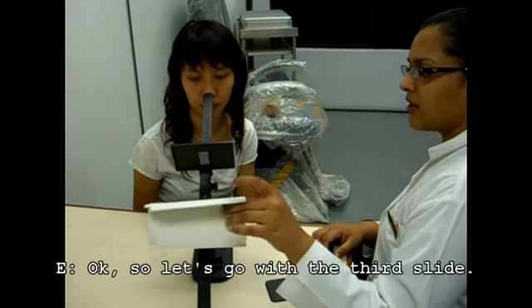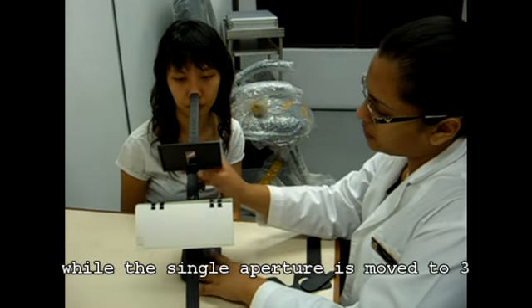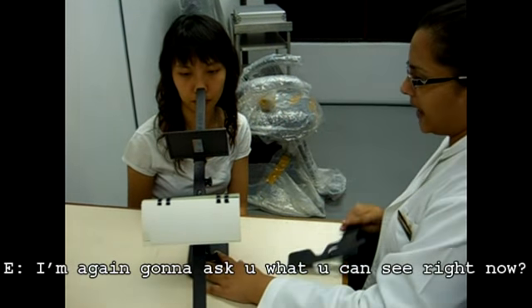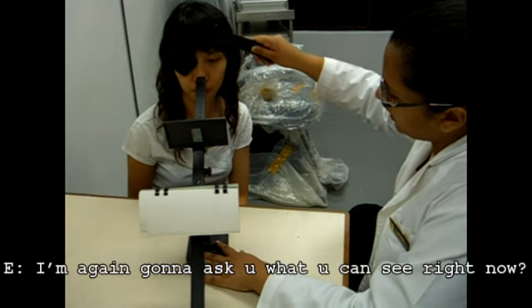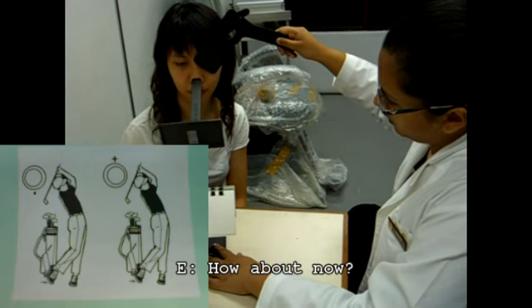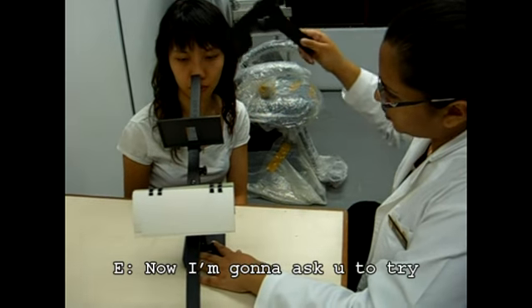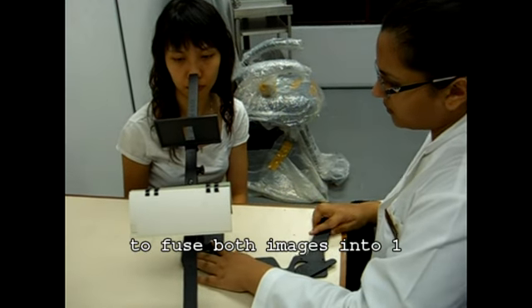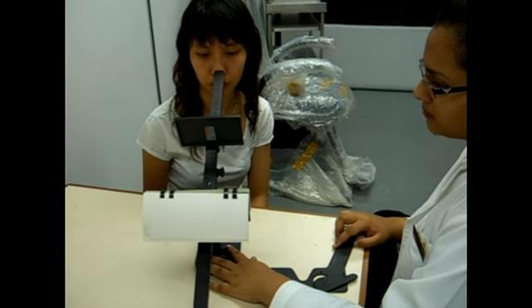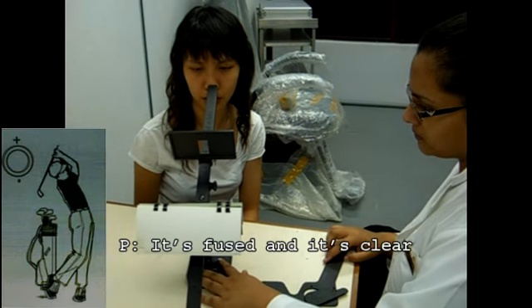Okay, so let's go with the third slide. The booklet is placed at 0, while the single aperture is moved to number 3. Again, what can you see right now? A golfer, a cross, and 2 circles. And what about now? A golfer, 2 circles, and a dot. Now try to fuse both images into one. As soon as it's clear and you can see one image, just let me know. Take your time. It's fused and it's clear.